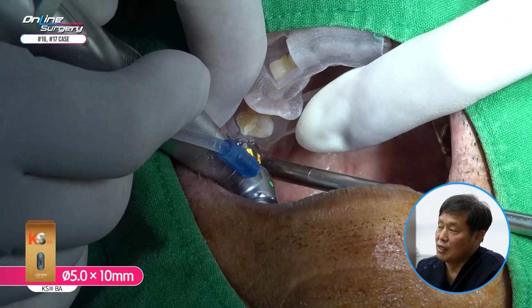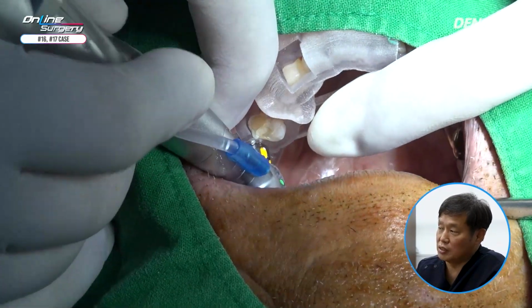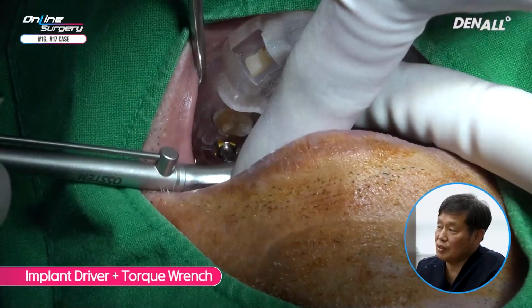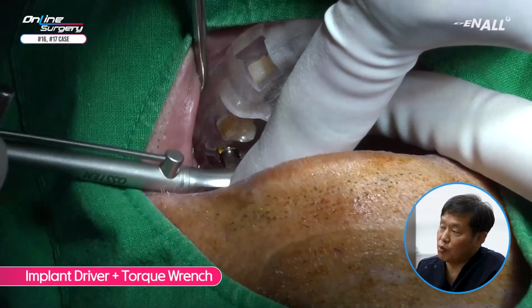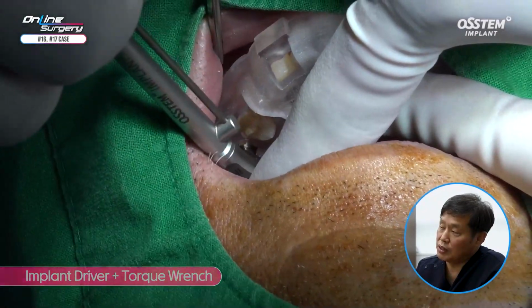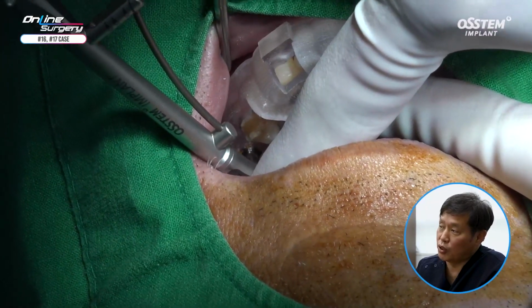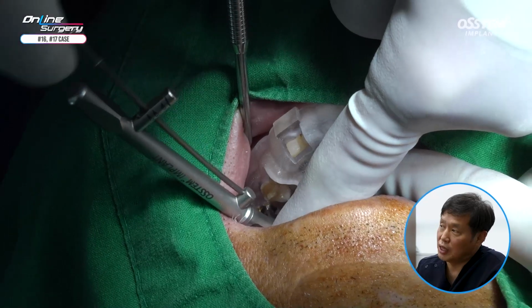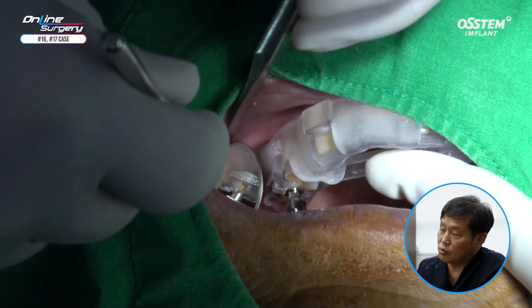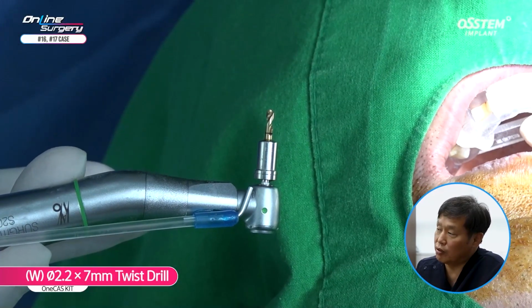Before placing the implant, the bone was harder than thought because of long-term inflammation. I think the septal bone area was harder. An implant driver and hand wrench were used to get the final implant position. The bone was harder than expected due to prolonged inflammation. You can see that there's sufficient primary stability. Yellow marking is utilized to check the final position.